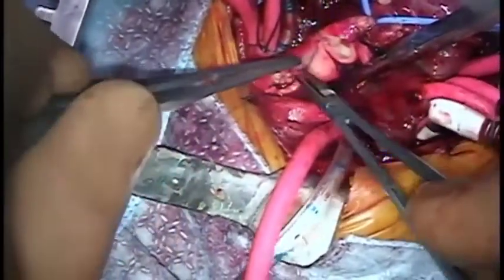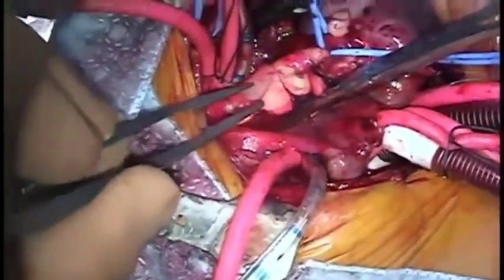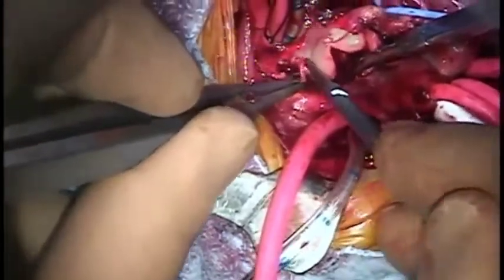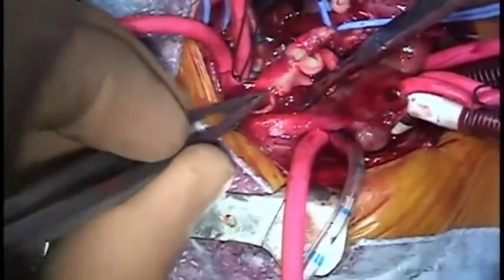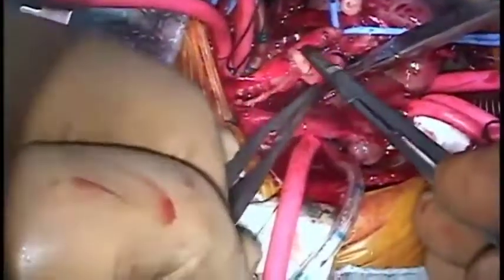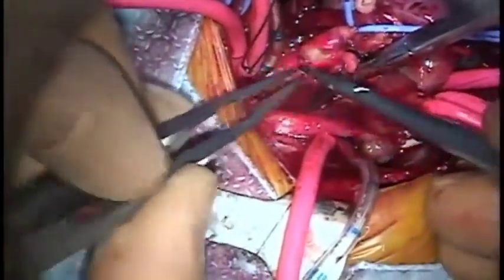The position of each segment informs the position of the next segment, as seen here, when the next section of the distal arch to descending aortic anastomosis can only be done once the position of the proximal ascending to arch anastomosis has been determined. The use of this tailoring principle continues here as we switch back to the proximal anastomosis, having completed the distal.